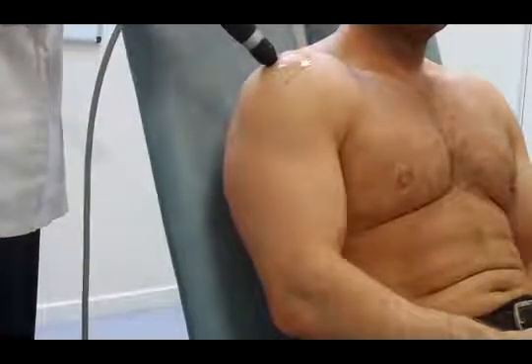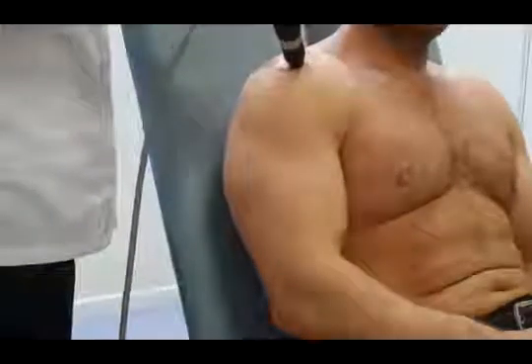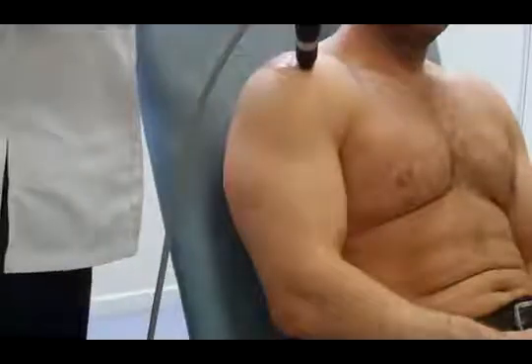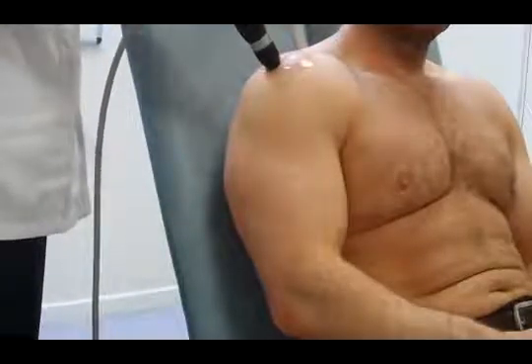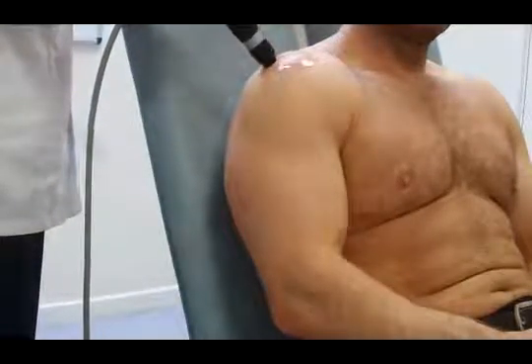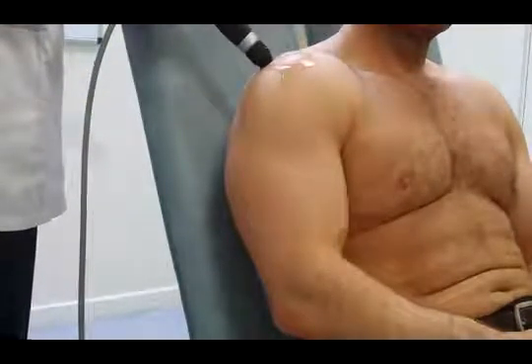It's not unusual to just stop on those areas and deliver about 200 shocks. Actually, to deliver enough shocks to produce cavitation on a single area, you'd really be looking at about 500 to 600 shocks. So we're not trying to create too much cavitation into the shoulder.